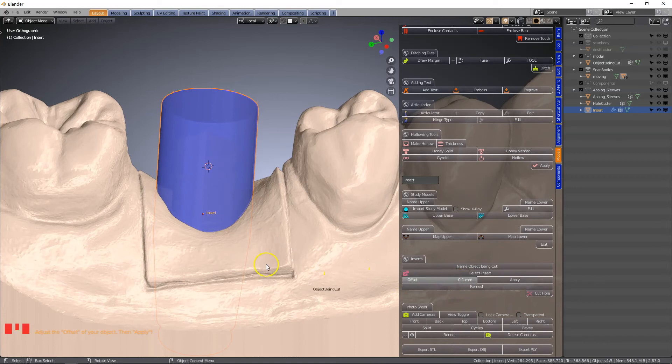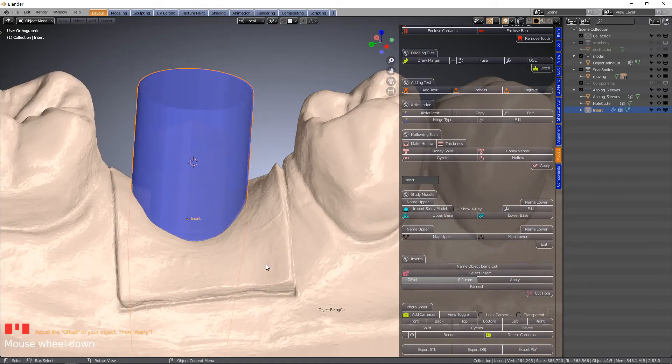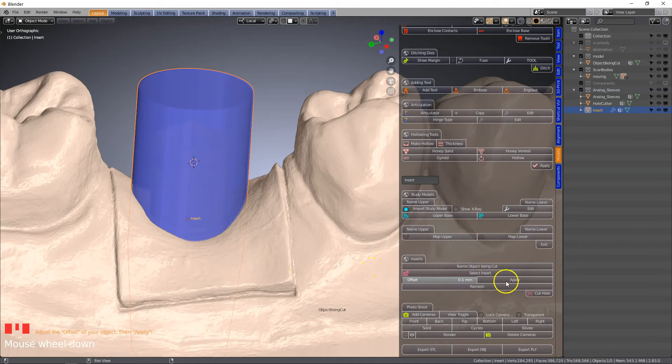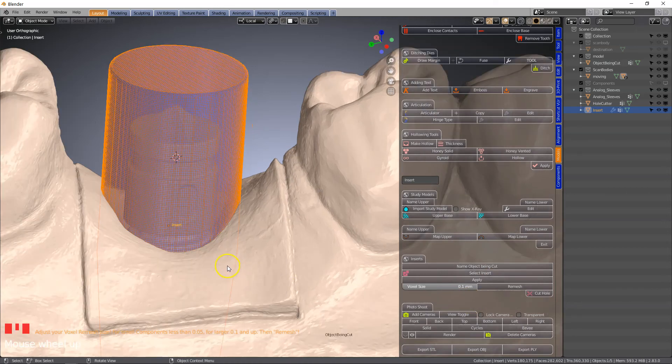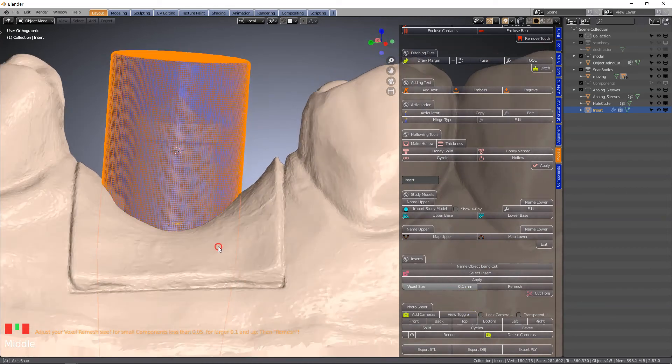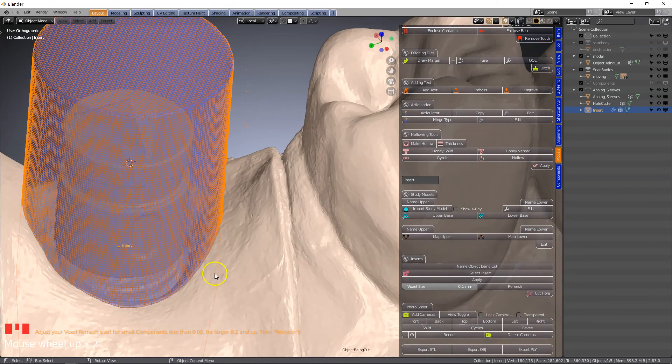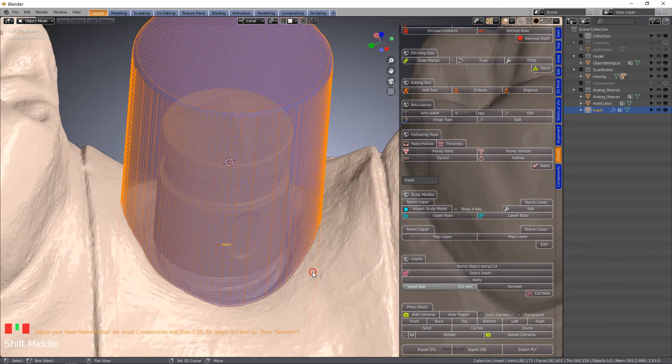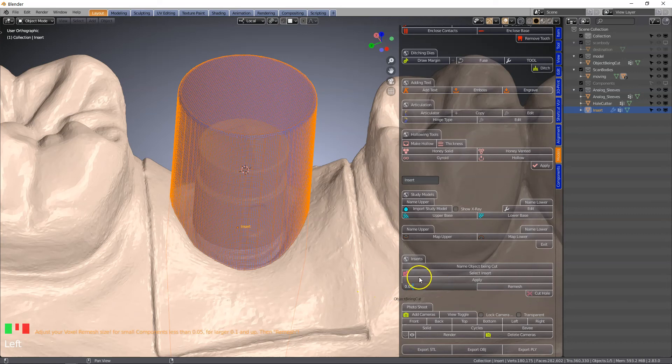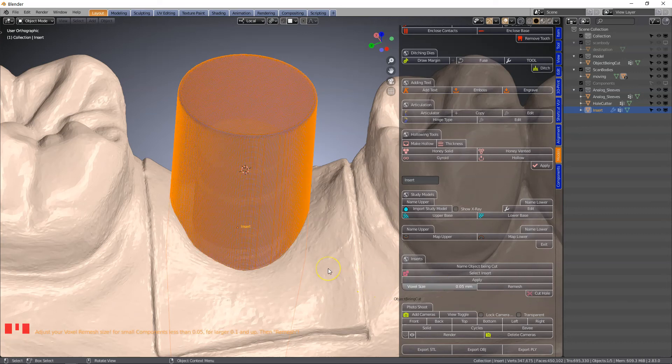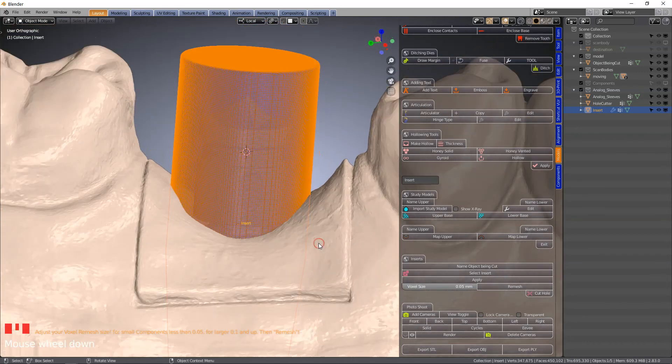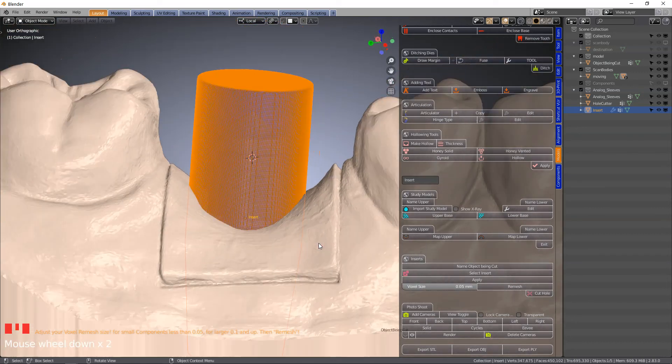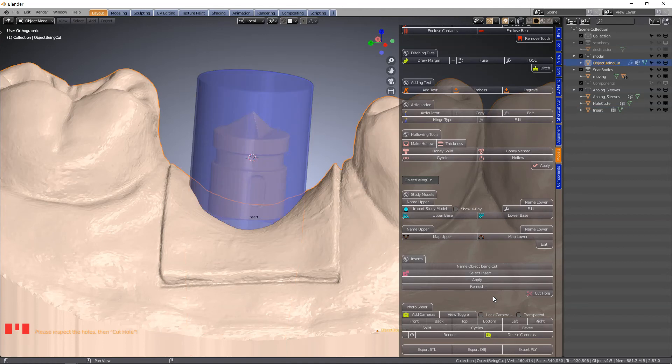You're going to need to experiment with your printer, but this is our default. Click on apply this offset. Next we're going to set the voxel mesh. The finer it is, the more accurate it's going to be. I'm going to set this to 0.05 to make it very dense. Then we're going to click on remesh, and then cut hole.